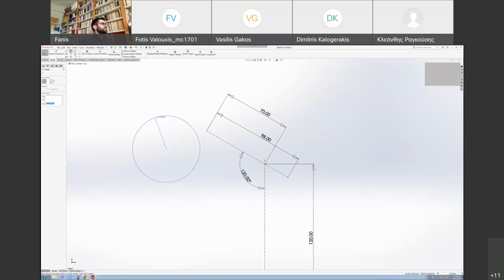So let's make the ball as well. Again, now I want the center of the circle to be coincident with this line. So you click on the one, you press control, you click on the other, you get this, you put coincident. Now this circle can move along this line, okay? It's constrained, it can move only along this line. And because of the geometry we have, I can pick this point, I can pick the circumference of the circle, and I'll say coincident.